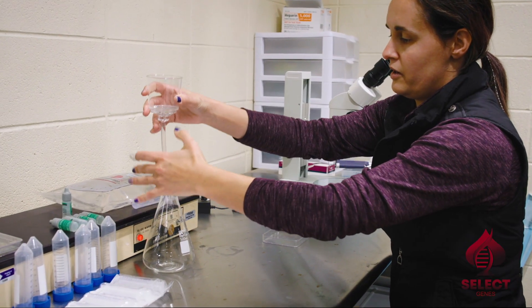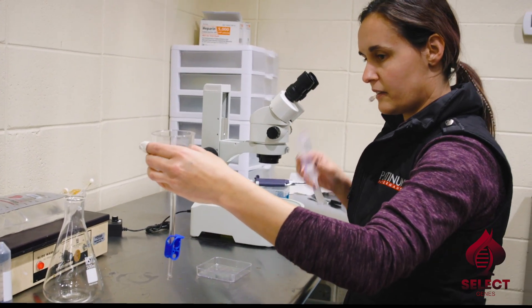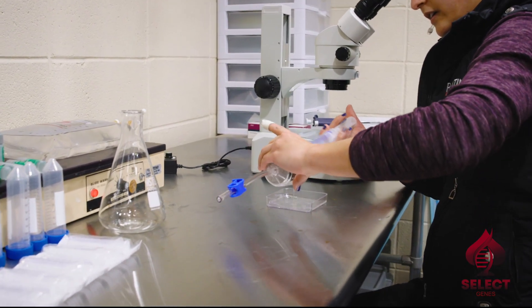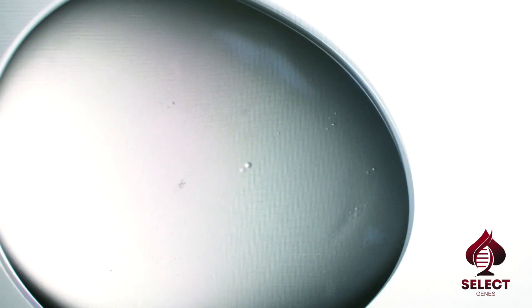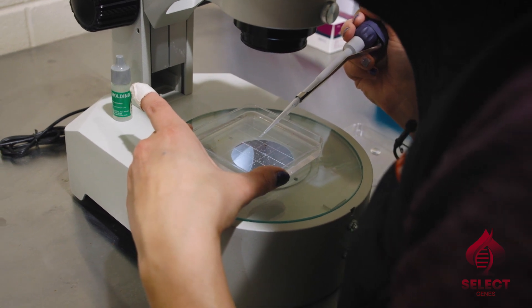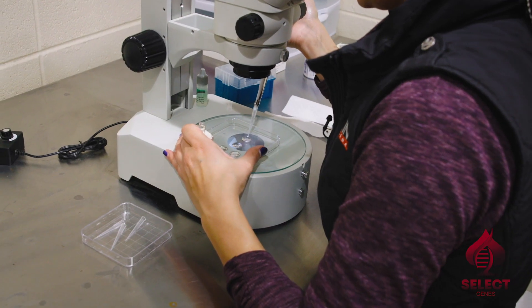We're going to wash our oocytes. Like I said before, they are microscopic so we can't see them right here. We're going to put them in this special dish and search for them under the microscope. The oocyte is the egg that the mare makes, and different mares make different numbers of eggs. You want to pick a mare that has a lot of follicles, which means she has a lot of eggs available to recover with aspiration. The more eggs you get, the more likely you are to be successful and get more embryos.